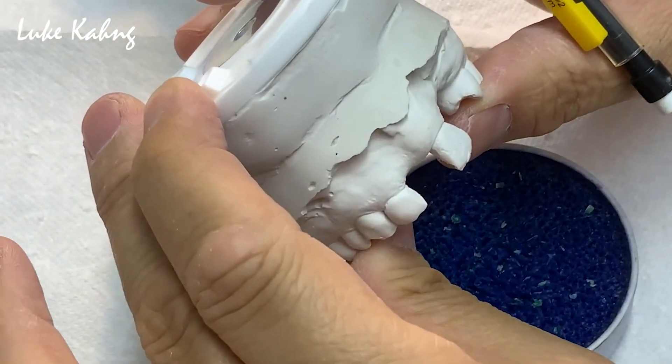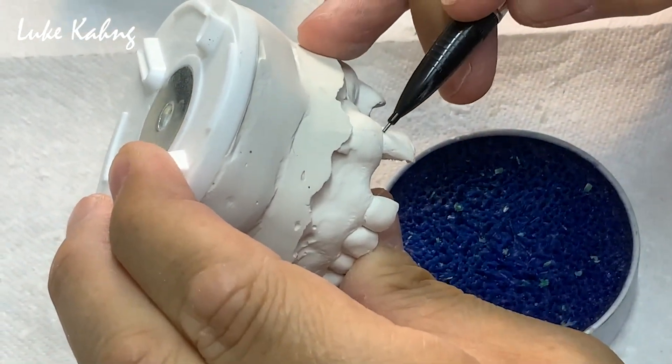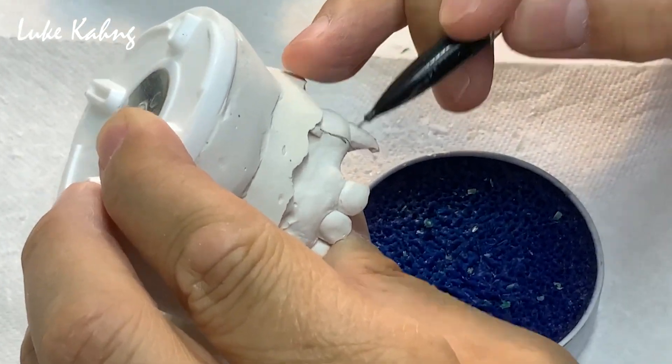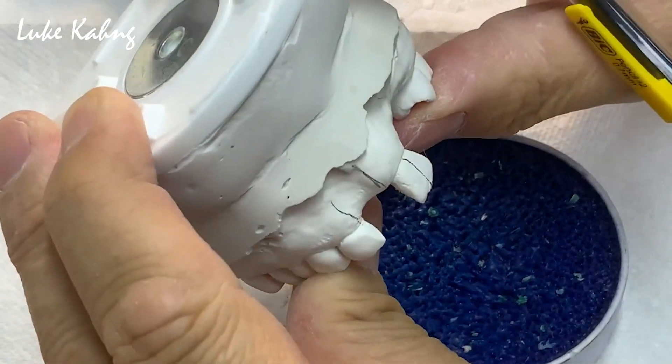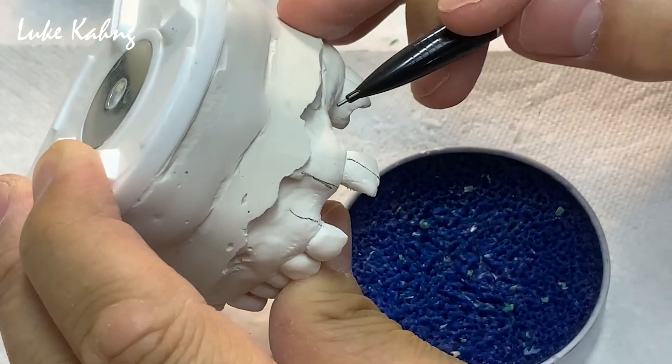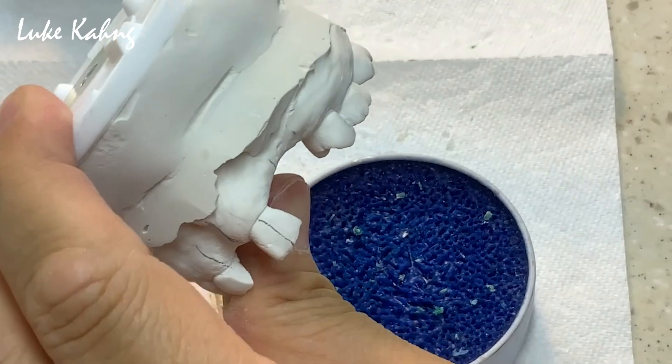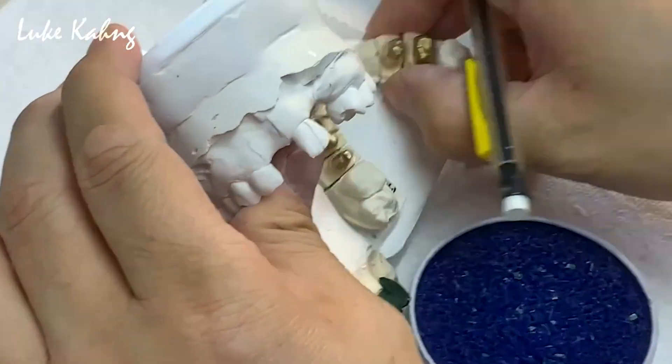First, diagnosis with study model — that's the key. From here I can make the guide. Here's the midline, here's the central right, here is the lateral.